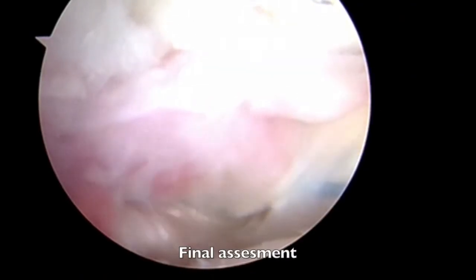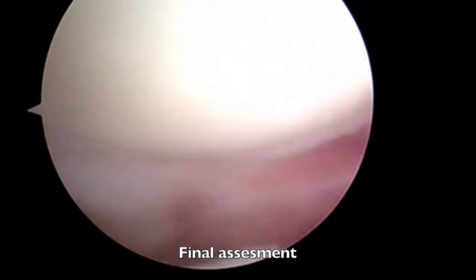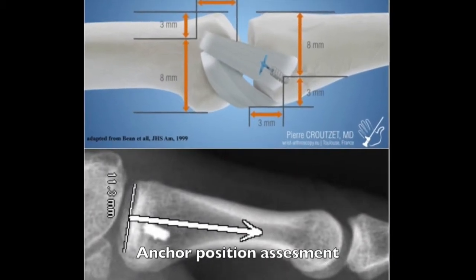Traction is released before the suture is tied. The final assessment confirms the right position of the sutures and good shape of the repaired ligament. Postoperative X-rays were analyzed and confirmed the right position of the anchor.